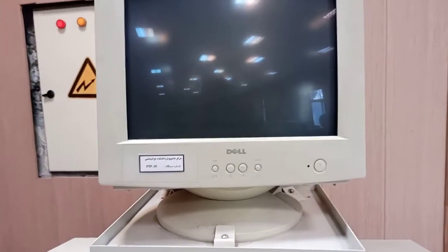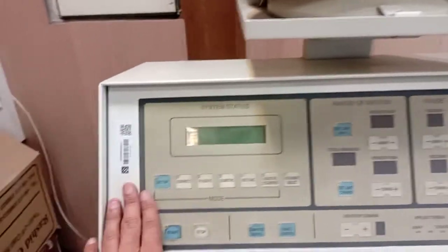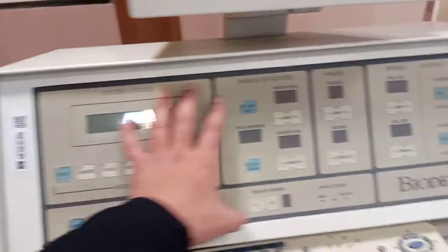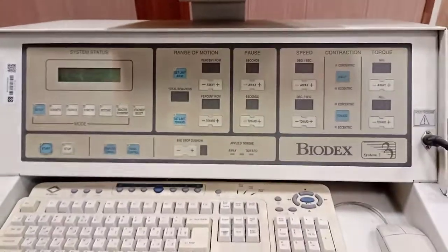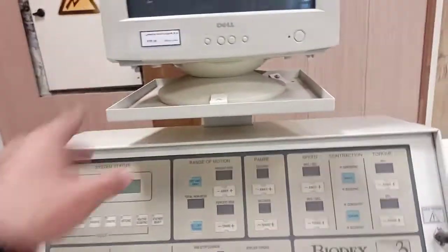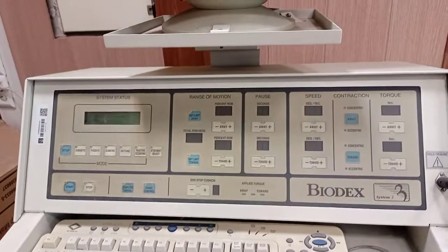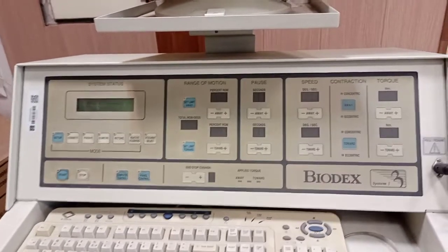Similarly, you need to turn on the monitor or the CRT. Once this unit is turned on, you can see some display and some lights over here. This is the control panel from the Biodex itself. You can choose this control panel or you can use the software that is built into the computer to manage the Biodex options.